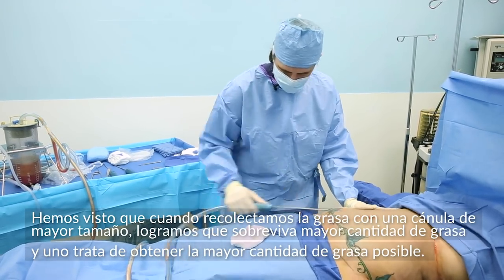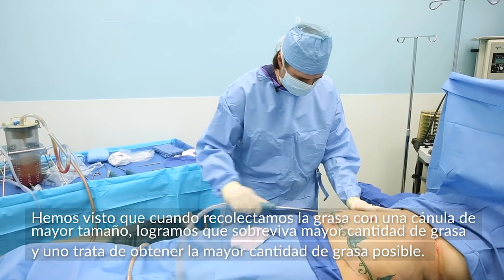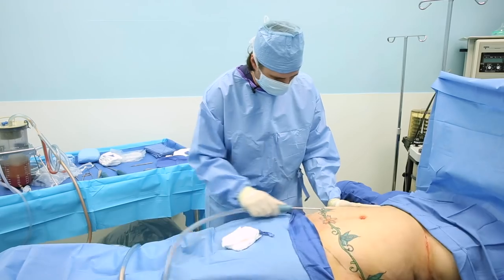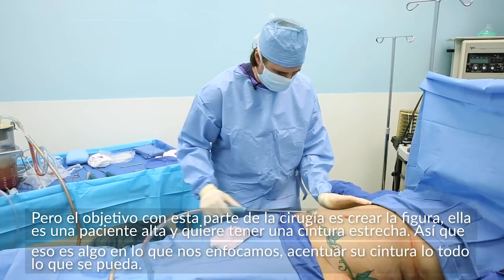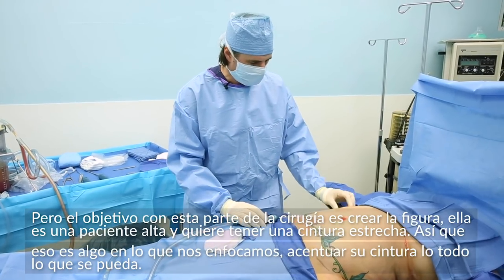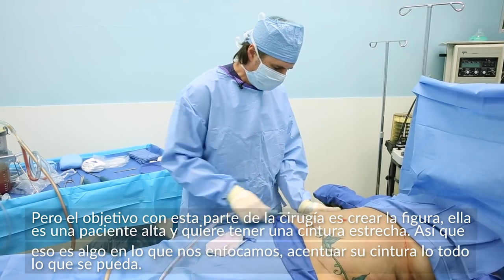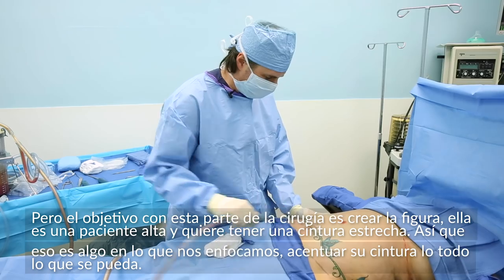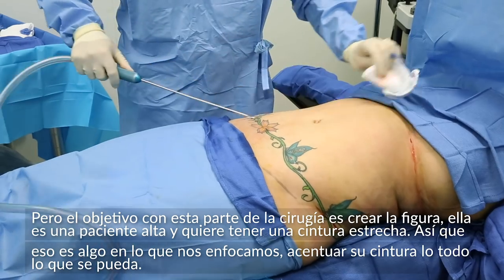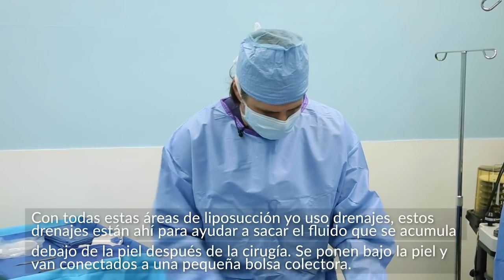I've found that harvesting the fat with a larger cannula has less damage on the surrounding fat cells. We try to harvest as much fat as possible, but with the liposuction portion of this operation, the goal is really to create shape and form. She's a taller lady who wants a narrower waist, so we're really focusing on bringing the waistline in and accentuating it as much as humanly possible with all these areas of liposuction.